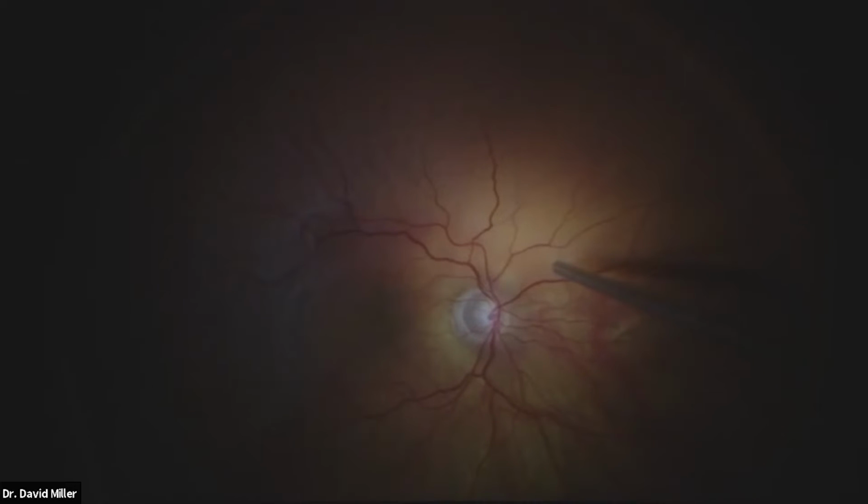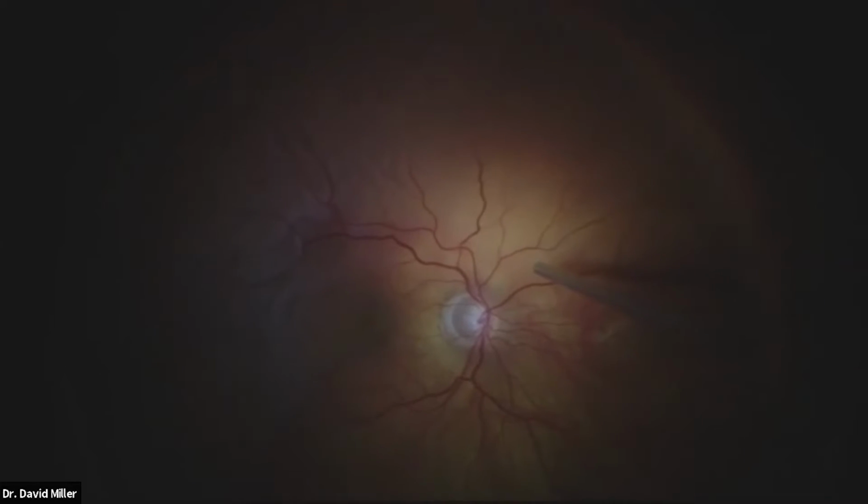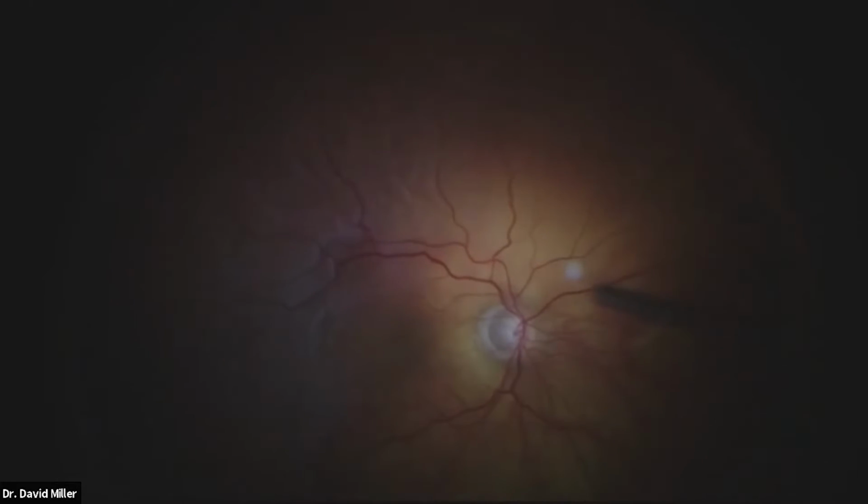And you're away from the macula again. And so we're going to drain right in here. Make a little cautery burn, so we can pop through the retina there and make a drainage site for ourselves. I'm going to come back and confirm the location of how we mark the retinal break with the scleral depressor, and put the light back on the other side where I can project the light onto the tear location.